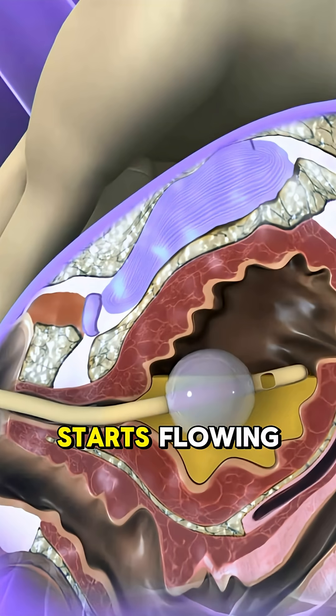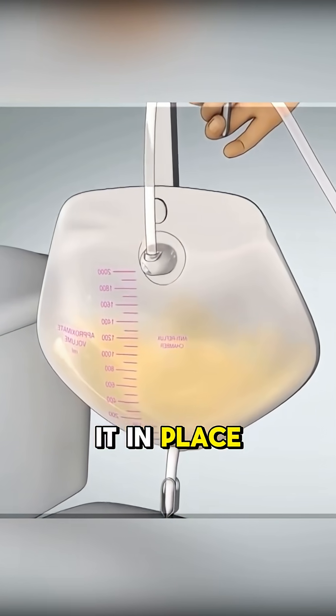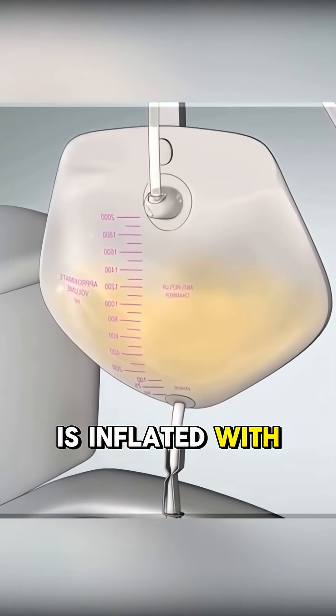The moment urine starts flowing, that's the signal that it has reached the bladder. Now to keep it in place, a tiny balloon is inflated with sterile water.